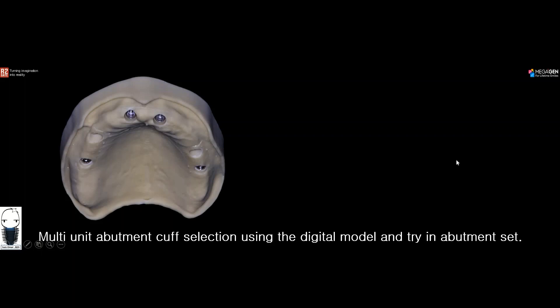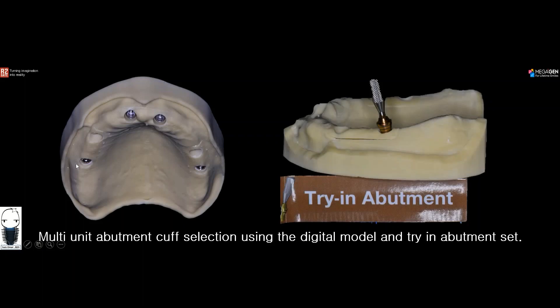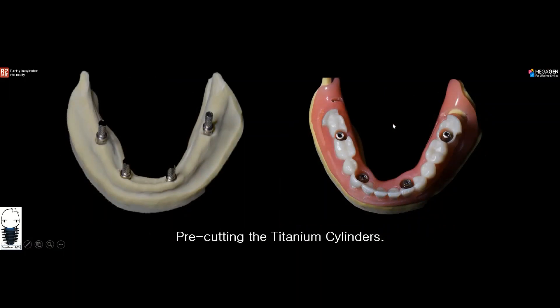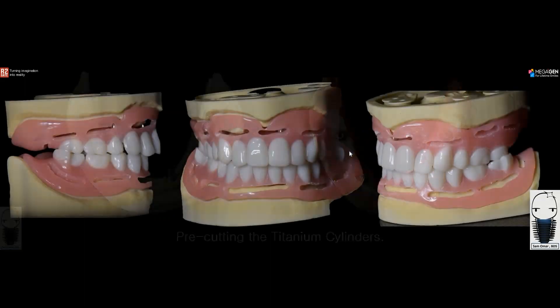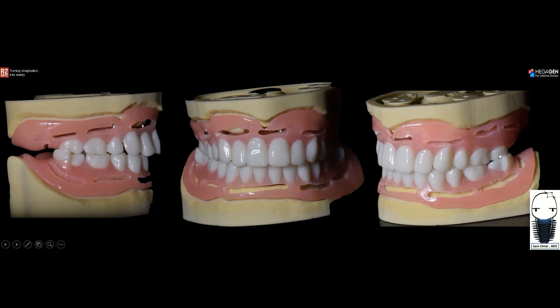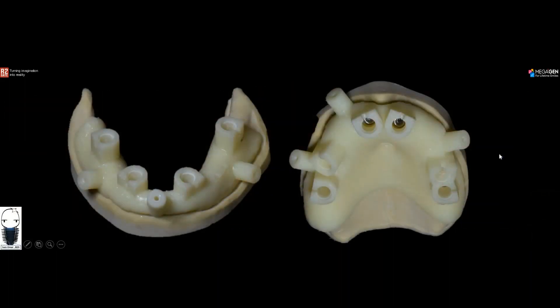To select the cuff height of the multi-unit abutments, I designed digital models, placed digital analogs, and used the Megagen multi-unit abutment try-in set to select the proper cuff height. I was also able to pre-cut the titanium cylinders based on the digital model and the height of the denture, which reduces surgery time. I designed the surgical guides that I would use at the time of surgery — two R2Gate guides were printed and now we were ready to start the procedure.